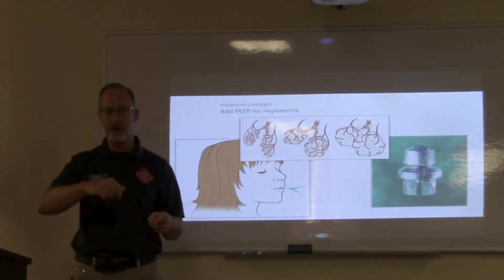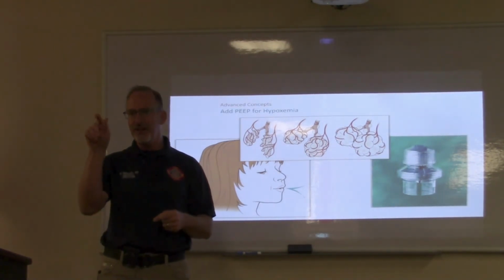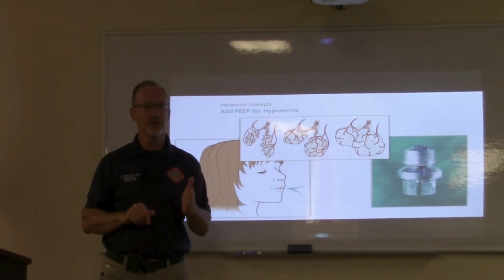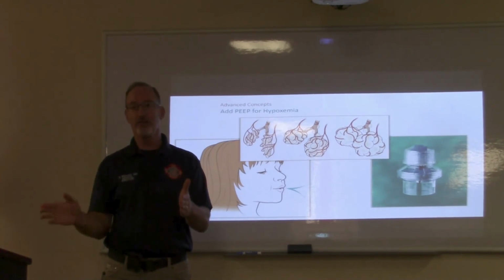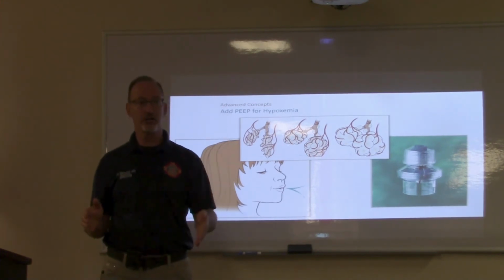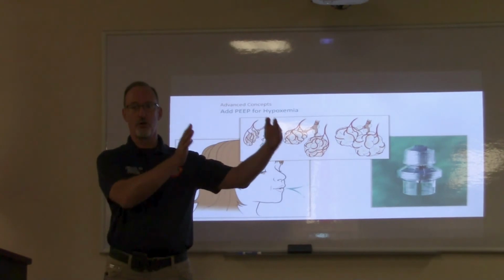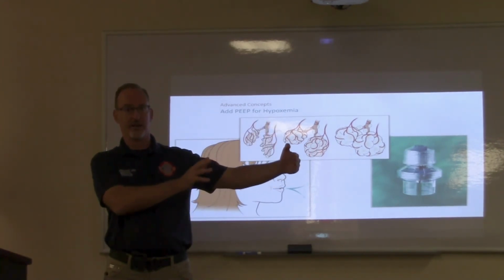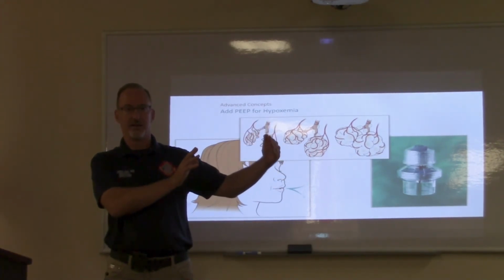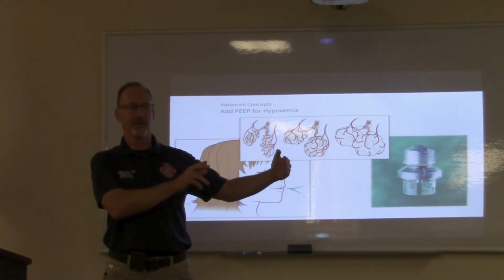Just like our vent, we can go 50, 100, right? We have more sophisticated vents, you can dial in exactly how much. So I can change how much oxygen. What else can I change? The PEEP. I don't change the rate, and I don't change the volume. Rate and volume control what? Ventilation, which is what parameter that I can adjust that to, that I can measure.